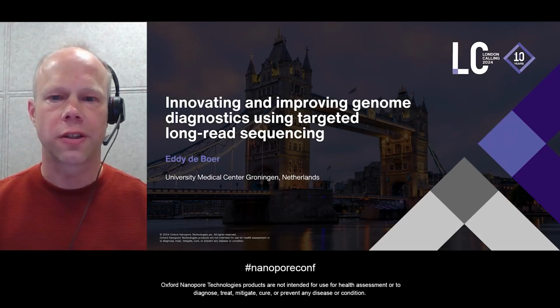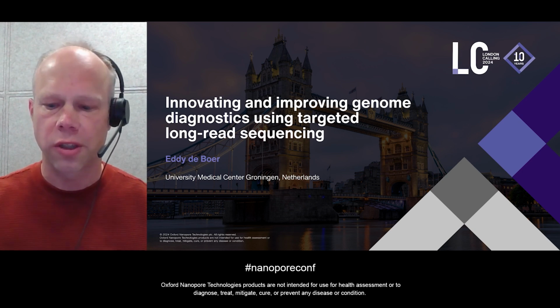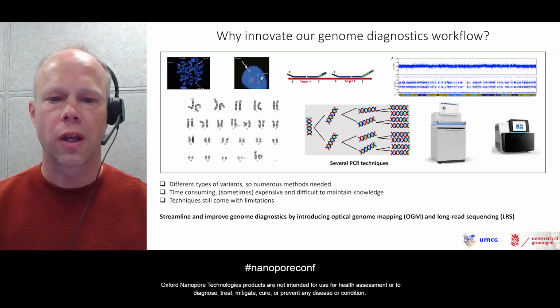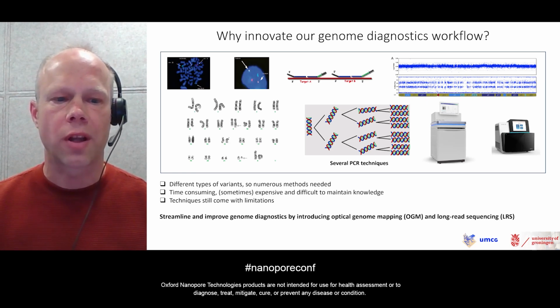In this presentation, I want to tell you how we try to innovate and improve our genome diagnostics by introducing long-read sequencing. So why do we want to innovate our genome diagnostics workflow? In our genome diagnostics, we need to detect different types of variants. For this reason, numerous methods are needed. This is time-consuming, expensive, and sometimes difficult to maintain in knowledge. And the techniques that we use still come with limitations.